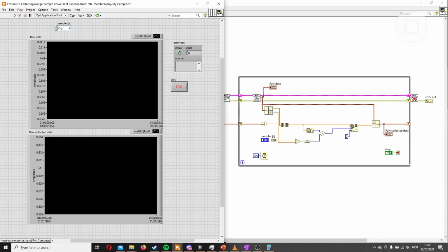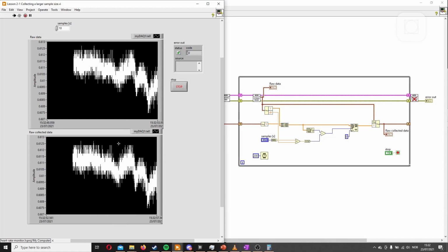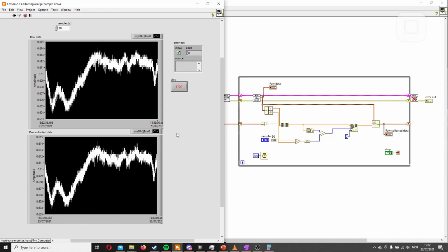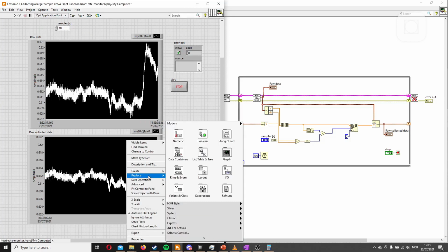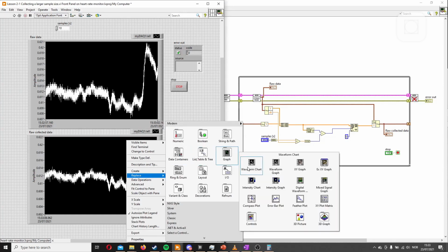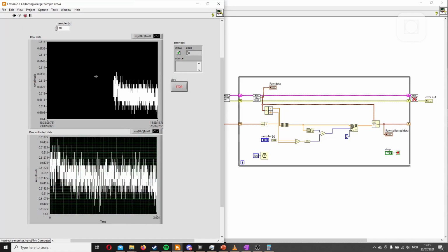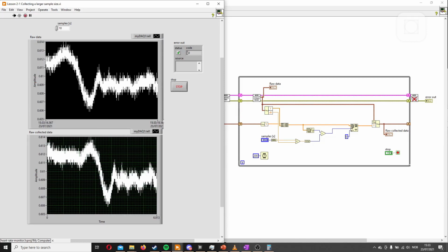We can test this now. What we'll do is just move this one here, and then write 10 seconds and press play. Well, we'll see now that it actually won't work, because we're using a chart here. I just copied this chart over here, and a chart only collects a certain amount of data. So what we want actually here is a graph. So we can just replace it with a graph, and we'll select the waveform graph. And now we have a graph, and let's try again. Because the chart kind of collects the data and does some of the work for you, but only inside of the chart and with the limits of the chart.